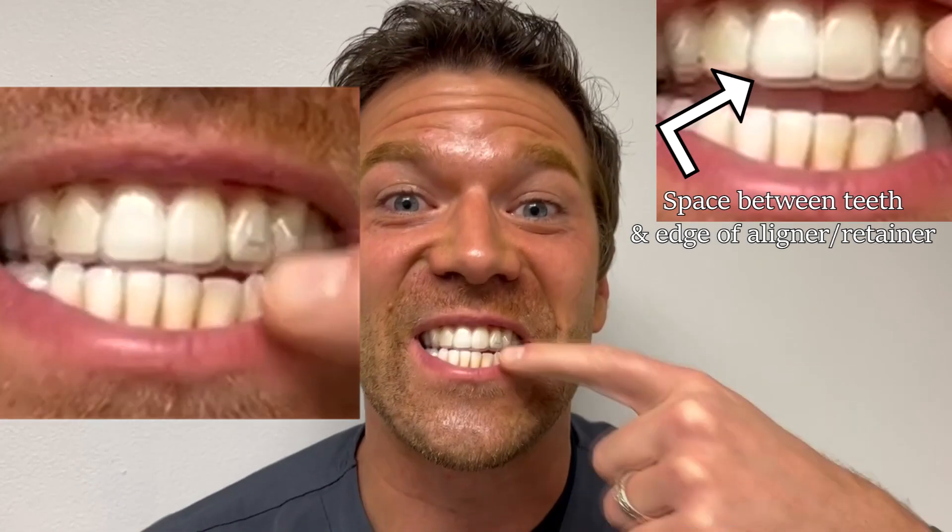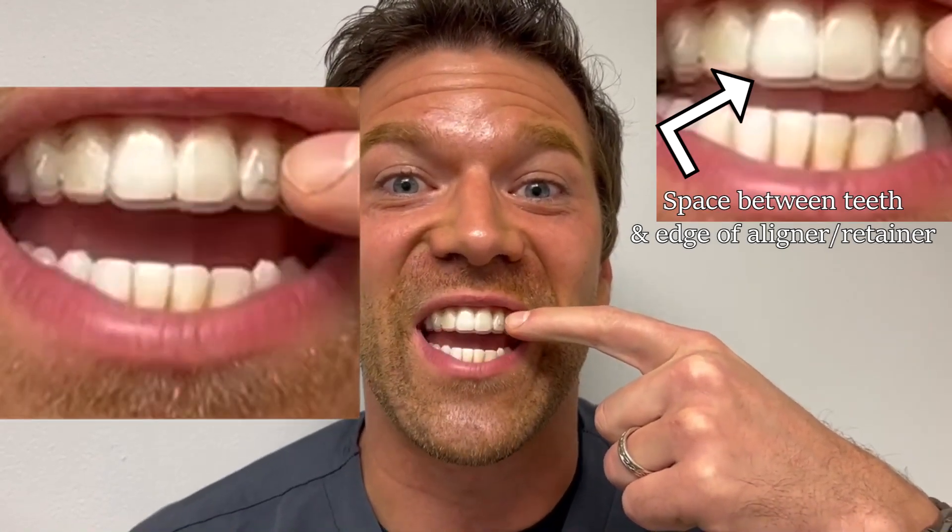Hey, this is a crazy orthodontist and I'm here to show you what to do if your retainer or your Invisalign tray isn't going down all the way. Can you see how there's space between my teeth and the edge of the aligner there?